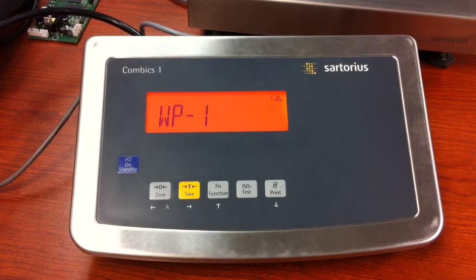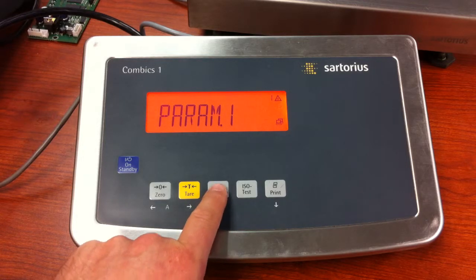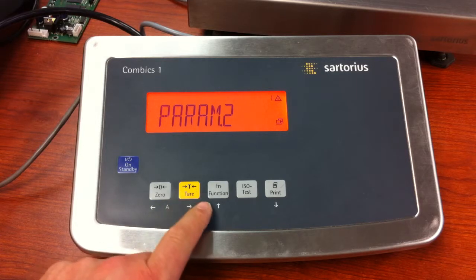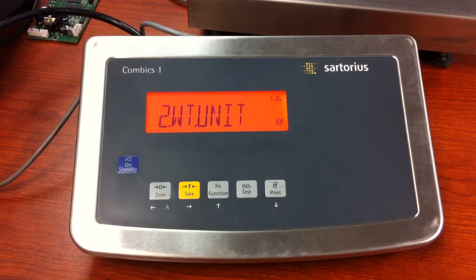Now press and release the function key until you see Setup, then press and release the tear key. WP1 — press and release the tear key. Then press and release the tear key again. We're at parameter one. We need to be at parameter two, because that's where we can define our second unit of measure. Press the function key to get to parameter two. Now press and release the tear key, and you'll see second weight unit displayed. Press and release the tear key again.